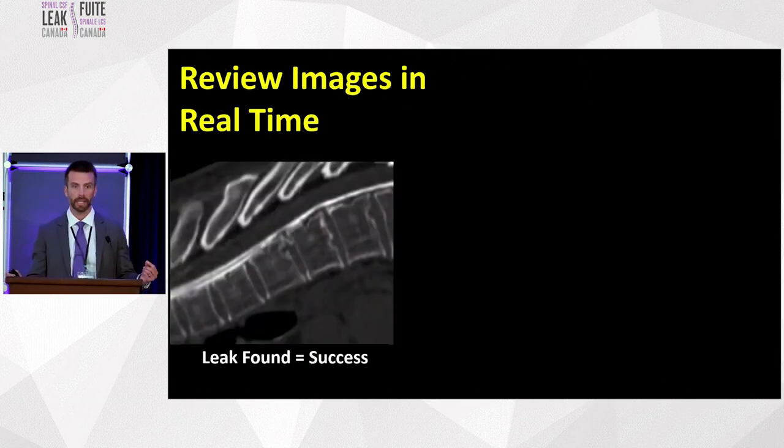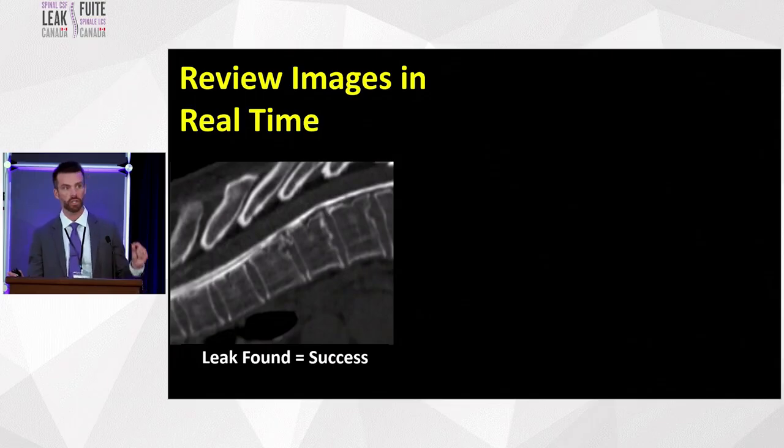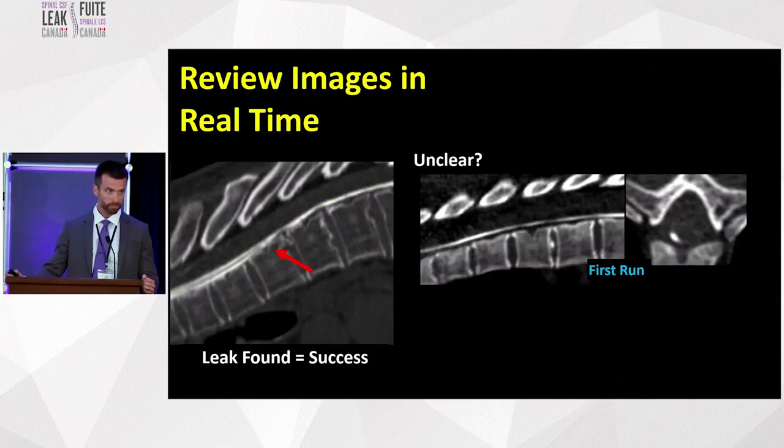And this is not an exam that you are just going to do, inject, and then walk out of the room and go get some coffee and read your images that afternoon. You're going to be in there the entire time with the patient and reviewing these images in real time. Sometimes it's very straightforward, like in this patient here. We see the split of contrast, we got the leak, great, it's a success. Other times, it's unclear, like in this patient here.